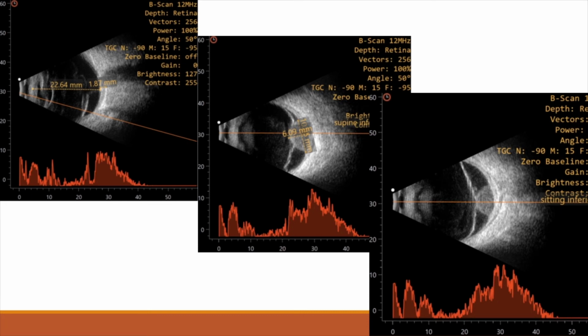You don't get backshadowing just because the echo comes back. When do you get backshadowing? When the echo is reflected back? When all the sound wave is reflected back. What does backshadow mean? A shadow behind something. When do you get a shadow behind something? When you're standing outside and the sun is behind you, when you block the light, you get a shadow.